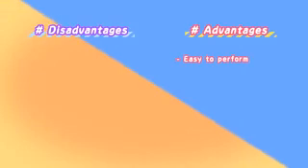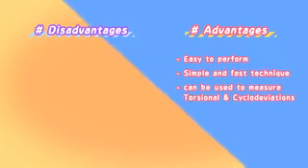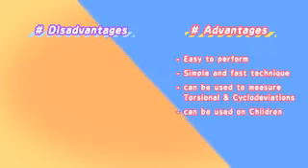Advantages of the Maddox Rod test. It is easily performed. It is a simple and fast technique. It can be used to measure torsional and cyclo deviations. It can be used on children.